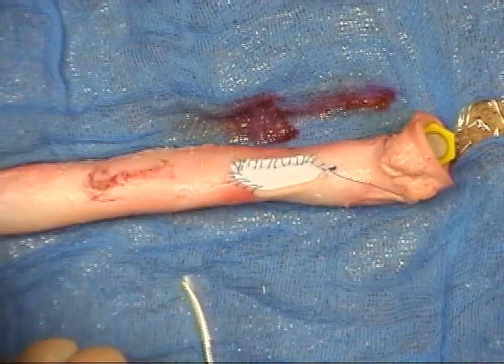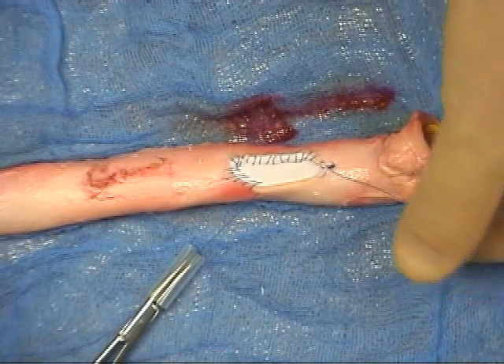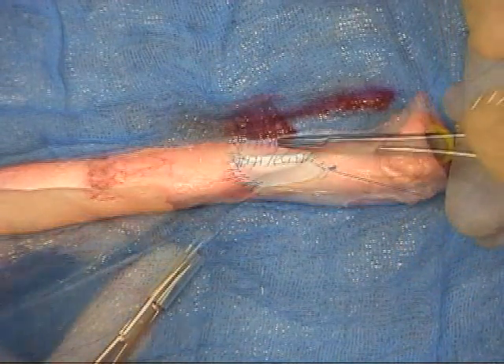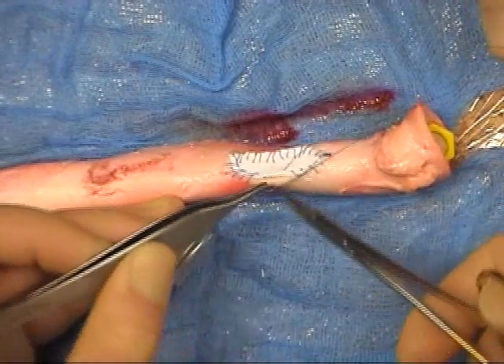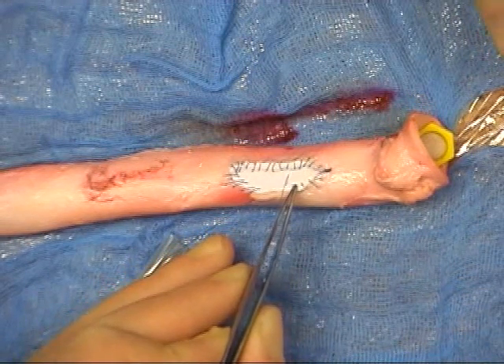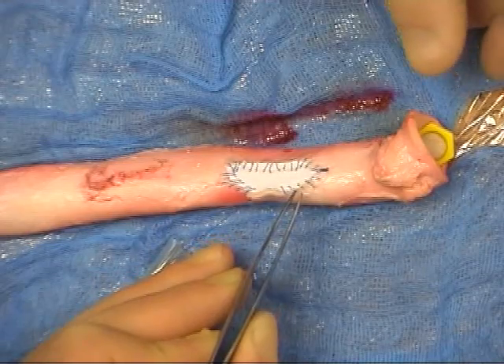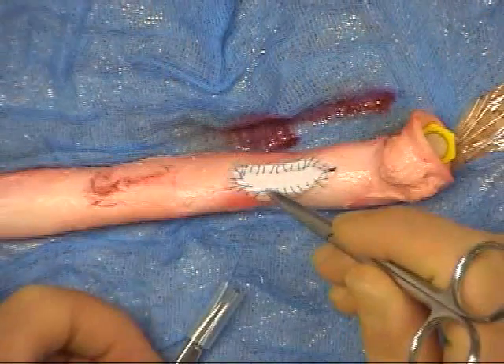At the apex of the opening, the needle grip should change from a backhand to a forehand hold. Once the distal end of the opening has been sutured, the thread is held in the rubber shod haemostat. The second needle is then used to fix the remainder of the graft in place, with the grip in a forehand position.